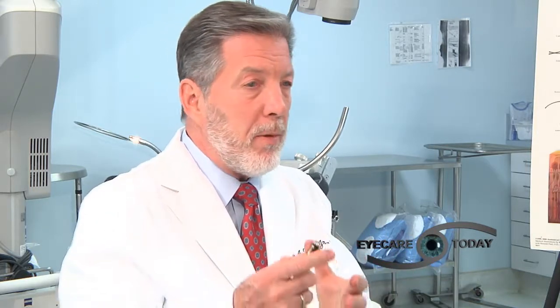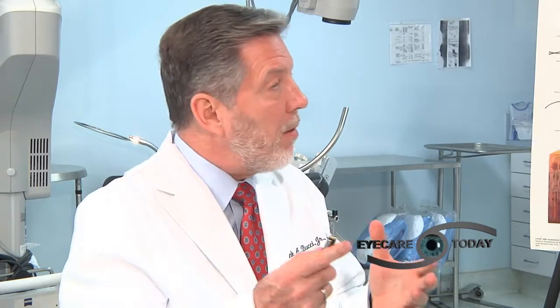So the other question would be, is this covered by Medicare? Or is this an out-of-pocket expense? Yeah, so no, this is an insurance covered procedure. It's covered by Medicare. So your typical cataract patient, they're coming up for cataracts, and they happen to be on glaucoma drops, and they've been fighting to control their glaucoma, and they can have this add-on procedure. Not a lot of time, not very invasive, not a lot of complications, and have better glaucoma control when they're done, and it's covered by insurance.